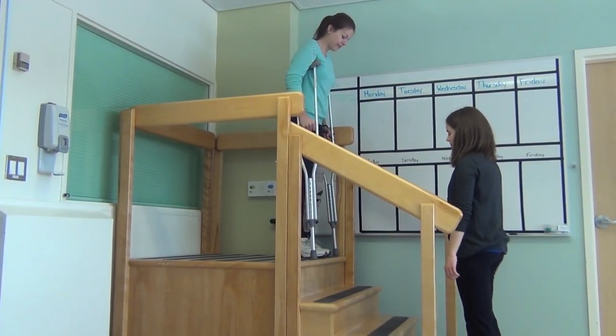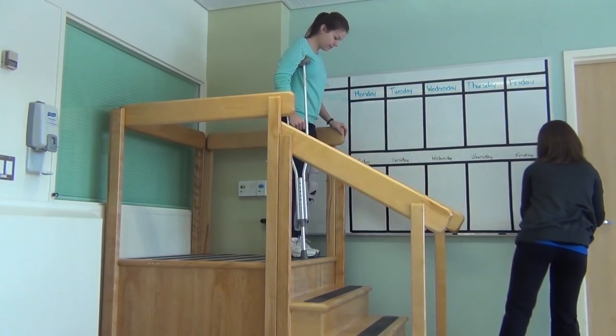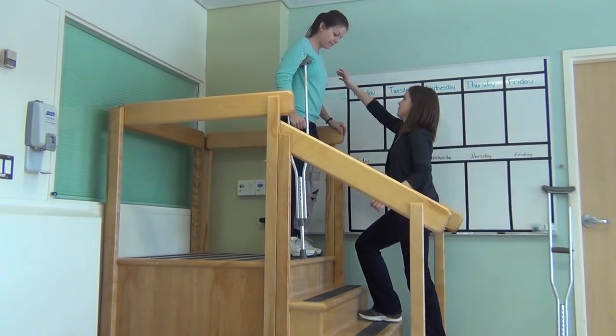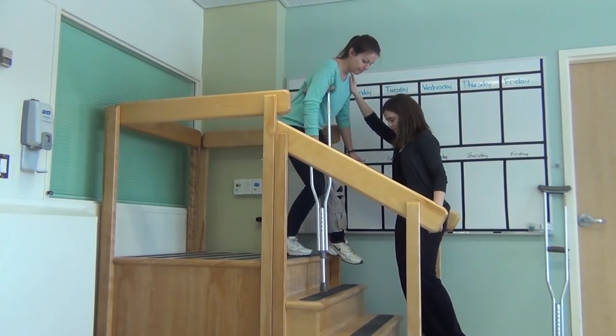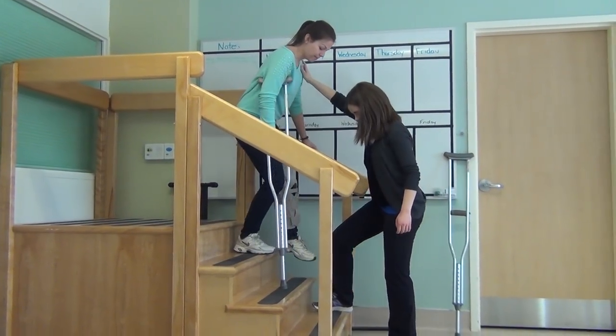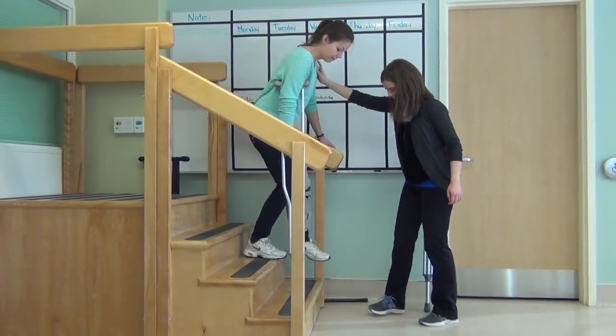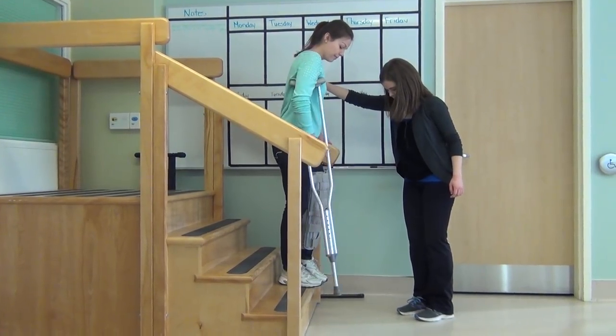When going down the stairs with a railing, start close to the edge of the top stair. Put your crutch on the stair below, followed by your injured leg to help with balance. Remember to only place the amount of weight the doctor recommended. Place all your weight on your hands and step down with your good leg. Remember that when going down the stairs, the crutches and the injured leg go first.